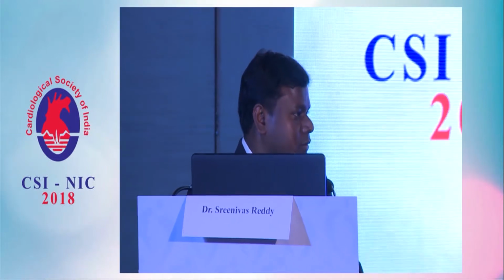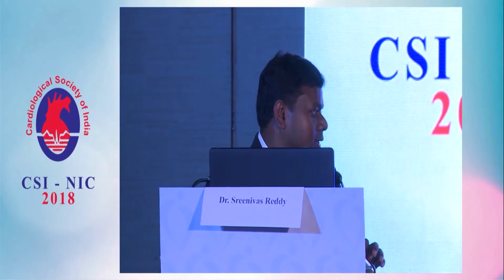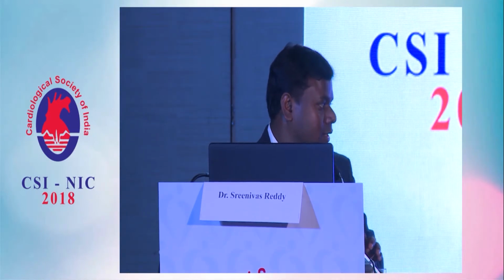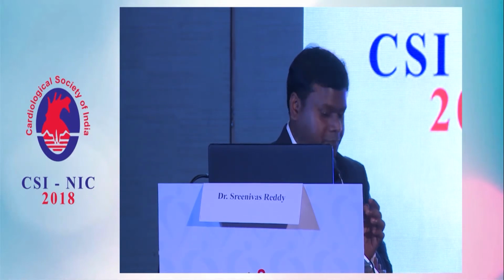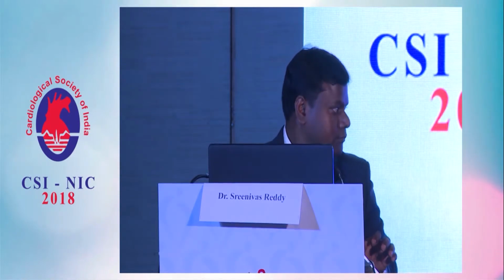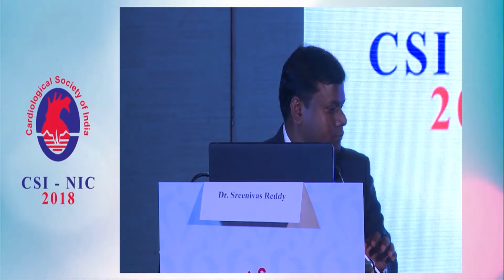So in this case, it was almost a 15 millimeter length, with a large side branch and a young patient. I think we considered a 2 stent technique. Proper apposition of the stent to the carina and carina formation, yeah, that is one of the most important things we have to see in bifurcation. And how much protrusion there is of the bifurcation stent into the main branch.